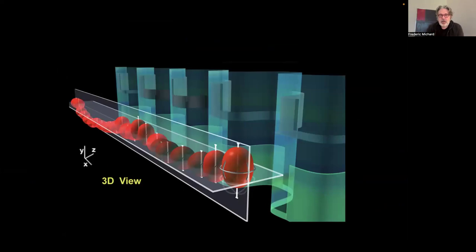And here is an example of, I think, a very creative proposal where every red egg or red ball would represent a heartbeat. The red color depends on oxygen saturation. So here, for example, this dark red would mean a decrease in SpO2, hypoxemia. The level of the ball depends on the blood pressure. So here I show you a hypotensive event.